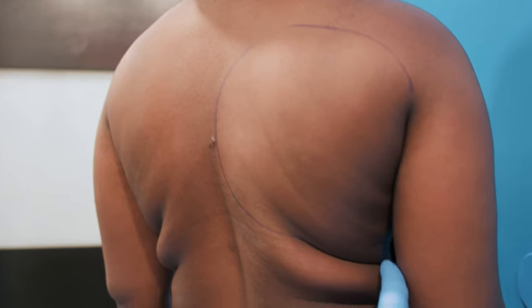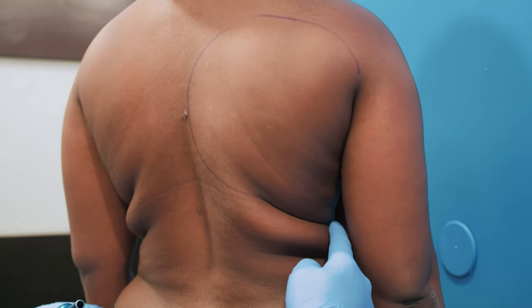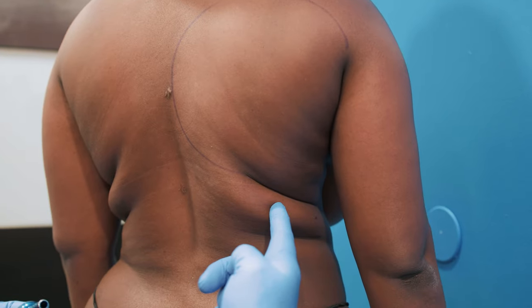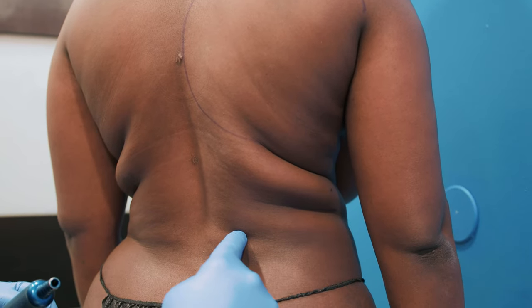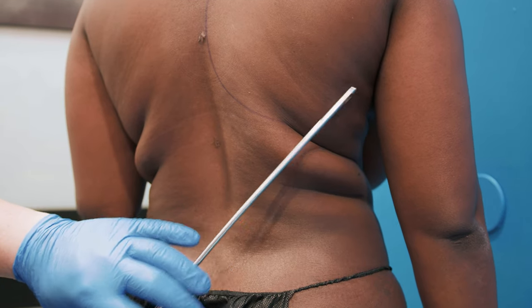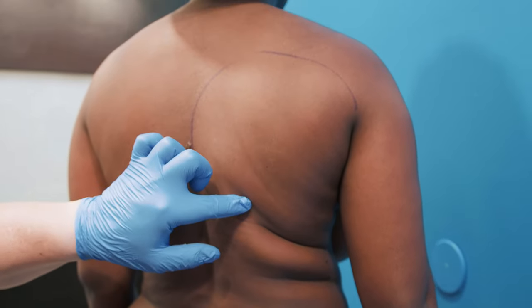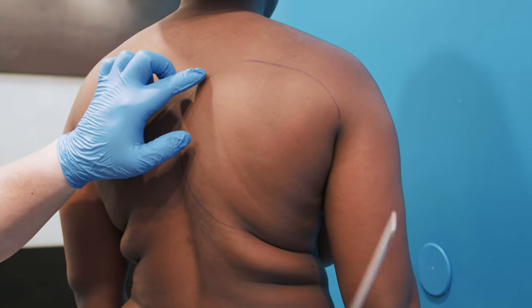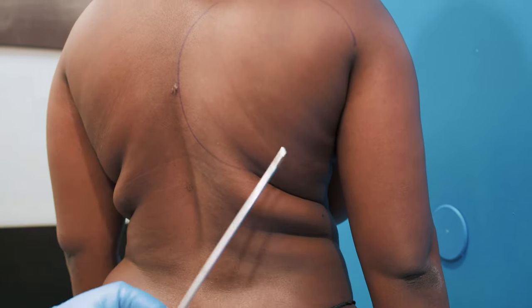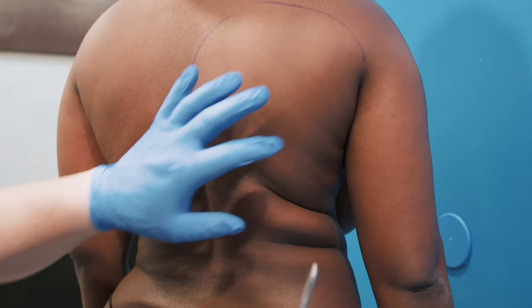I make an incision in the front that allows me to get this area and this area, and I make an incision around here to get this area as well. So I really attack this area from four places so that we're getting all of this fat.